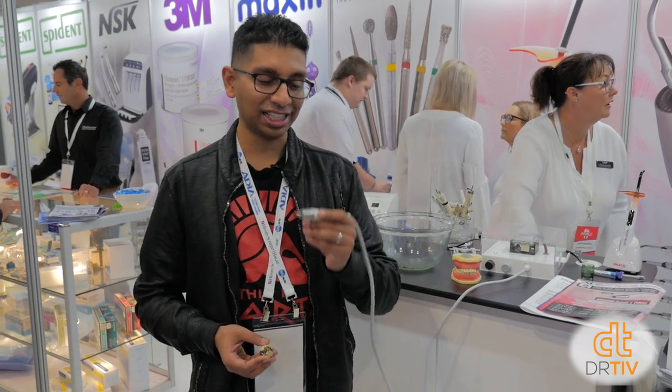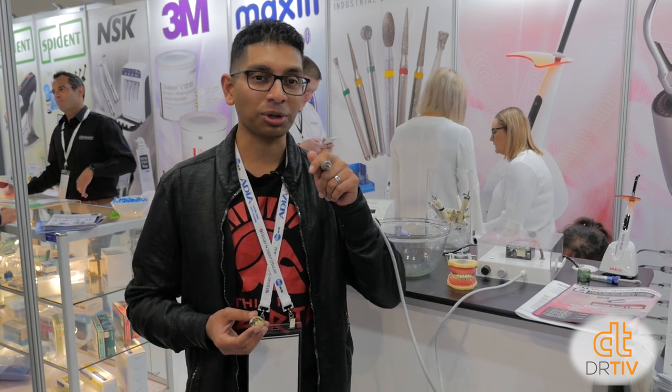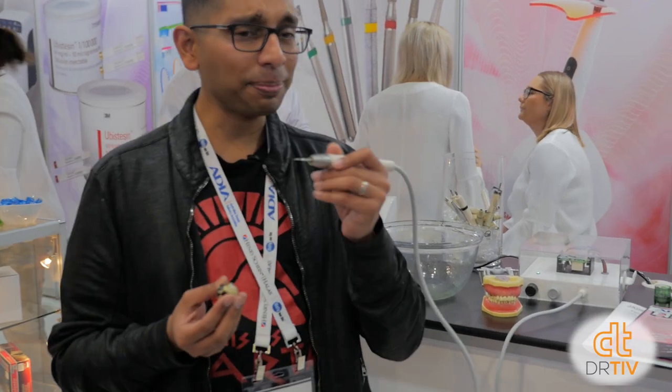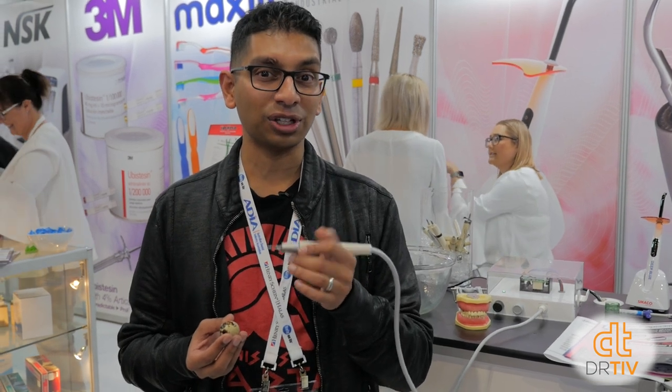I'm at Independent Dental with the Smacko handpiece — the model name is Jade. Unlike regular EMS scalers where the tips vibrate in all directions, this one only vibrates backwards and forwards. That means you get lots of bacterial removal motion on the sides without causing damage to the teeth — and that's why I've got a quail egg to demonstrate with. I'm going to try and scale the quail egg without breaking it, which is apparently really easy. The non-LED version is $244 and the LED version is $550 for two. At ADX, you can actually take them both home for 28 days free — only charged if you keep them.